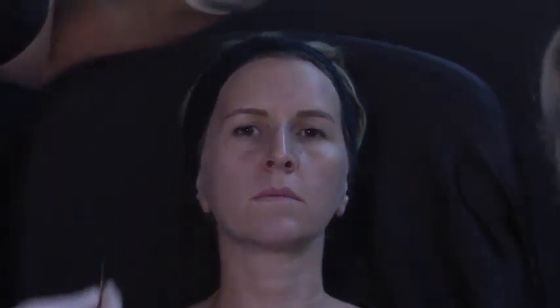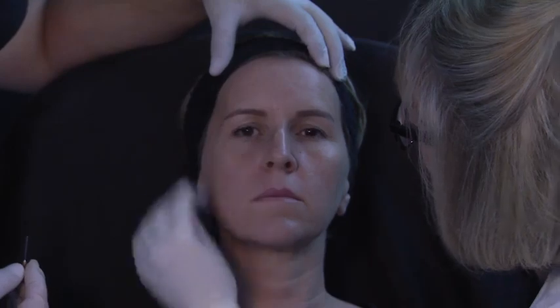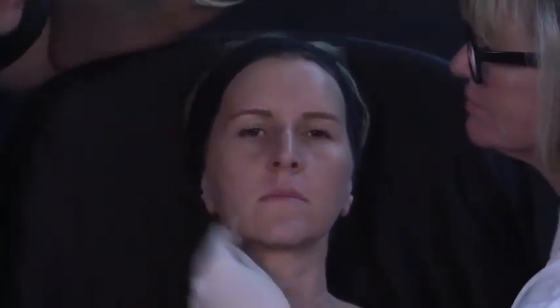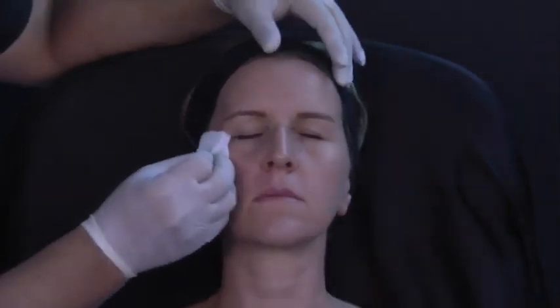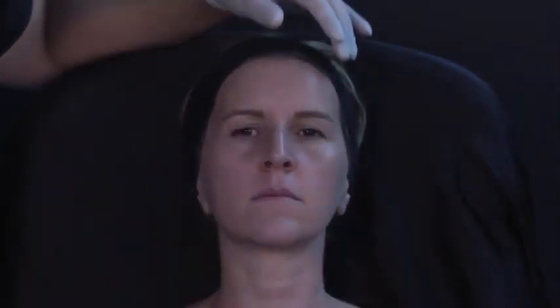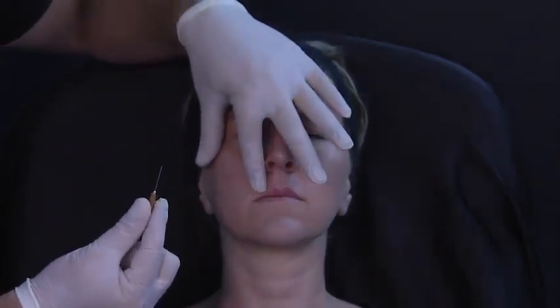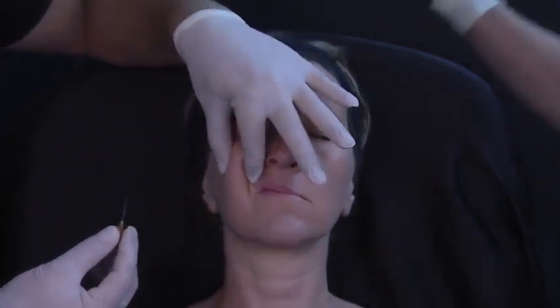So we disinfect first. Remember, disinfection is crucial in all our injections. So we are disinfecting now. I'm going to use a 25G cannula. I normally try to use the same size of the needle and cannula, so it's an orange needle for a 25G cannula. I'm going to pinch the skin.